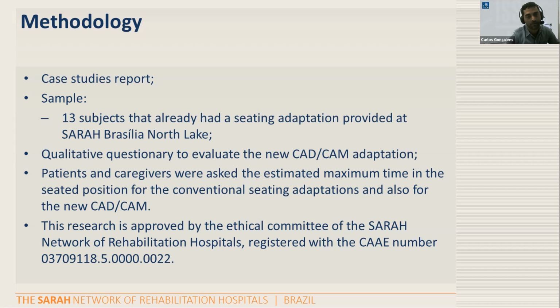So they were all subjects with severe deformities, and they were eligible for using this 3D seating workflow. We also made a questionnaire to evaluate the feedback of the new intervention. And also we asked the patients and caregivers the estimated maximum time while seated. So that was our major metric for this research.